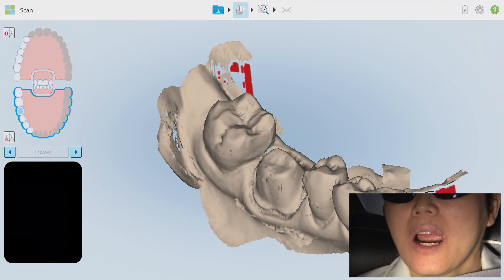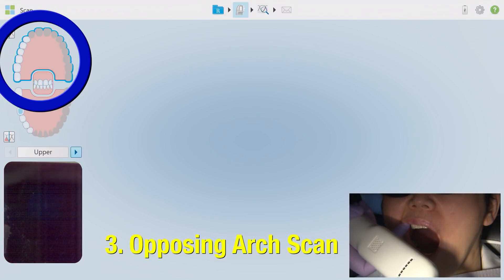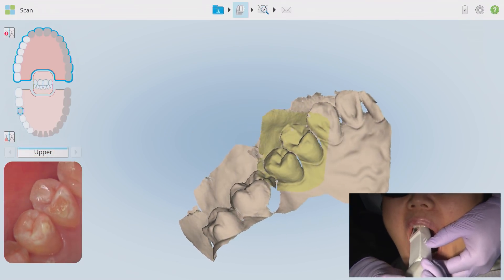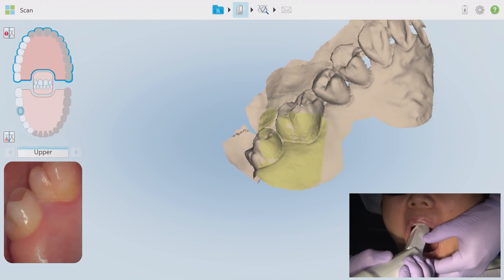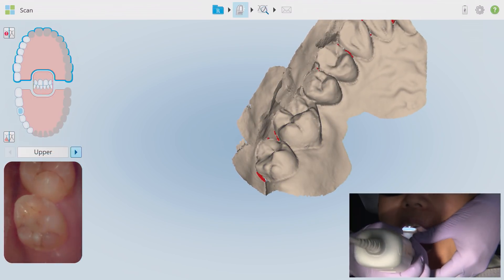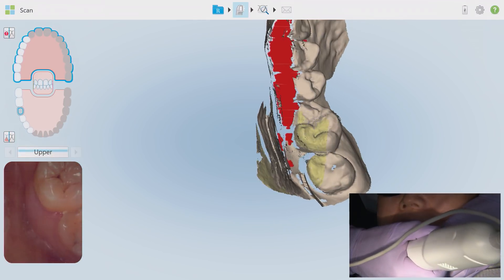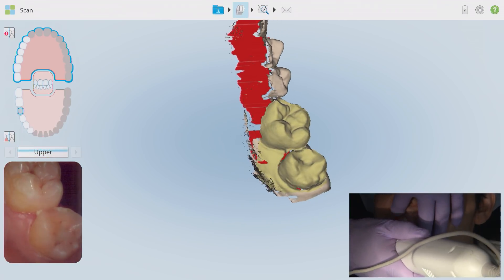Moving on to the opposing arch — in this case the maxillary quadrant — I've selected it on the visual chart. The principle is the same as the working quadrant scan but without the tooth prep scan step. I'm starting distal occlusal of the most posterior tooth in the quadrant, scanning deliberately towards the cuspid area, wrapping around to the lingual, and heading back towards the molars, twisting for embrasure areas. I then stop to reset for the buccal, always starting again on the previously scanned occlusal surface until the iTero recognizes the segment and meshes, then wrapping around to the buccal and moving towards the anterior. I'm changing up the hand grip to steady the wand and counteract the patient's lip resistance.